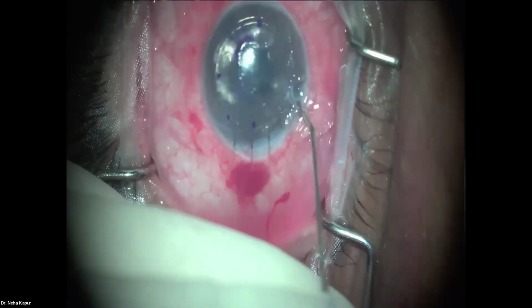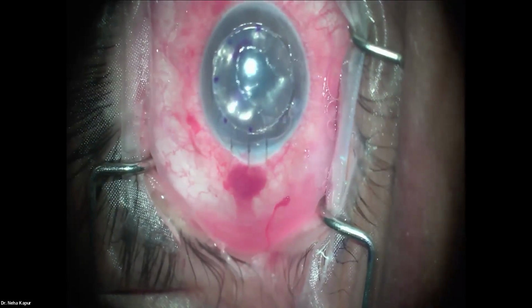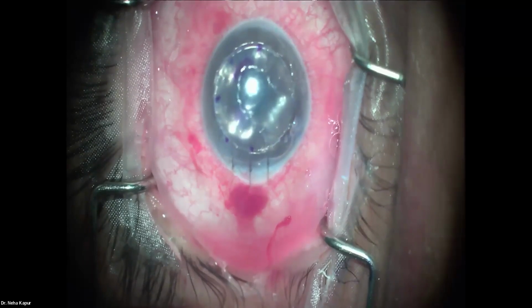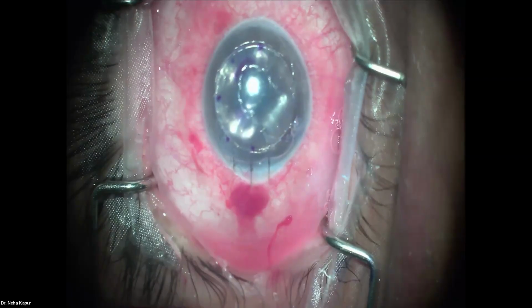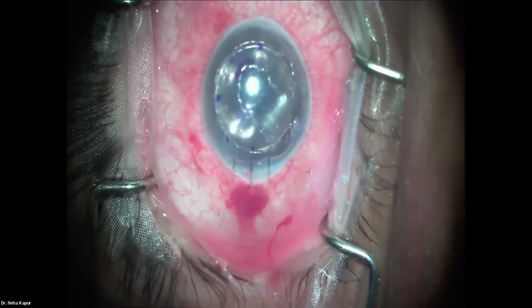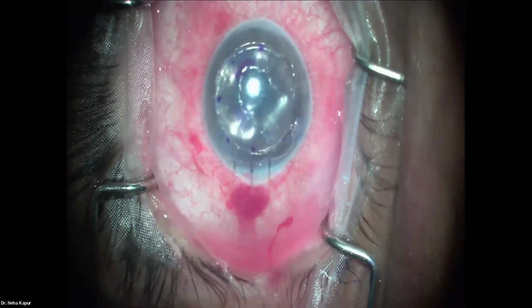That's a good time, because sometimes even if you have a reverse orientation of the graft, it may appear stuck, but it's actually the bubble keeping it in place. So at day 3, it's good to see the patient one more time to ensure that the graft is still in place in the right orientation and the pressure is fine. We like to see the patient at day 1, day 3, a week later, and if all is well, a month later. But if the cornea is not clearing, we like to see them sooner.